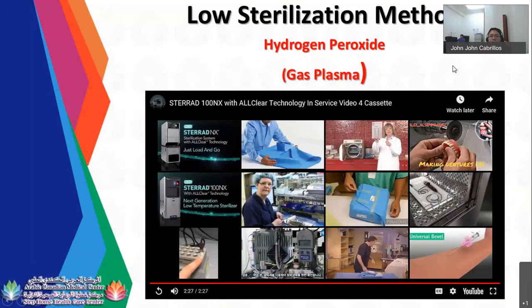So you need to check before opening, and you need to wear proper PPE, which is your chemical resistant gloves, your green gloves. You need to read the label to see if it is expired or not. You need to check the integrity of your packaging, which means you need to check if there is any liquid or dampness or wetness on the package. Aside from that, you need to check the line, which is sometimes white, sometimes yellow, and will turn to red once there is a leakage.